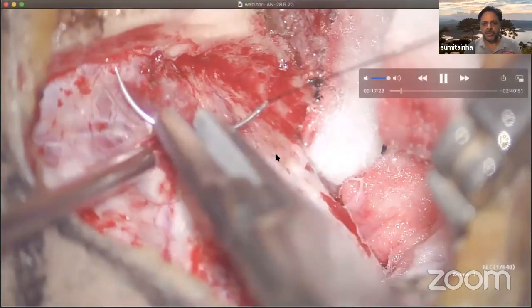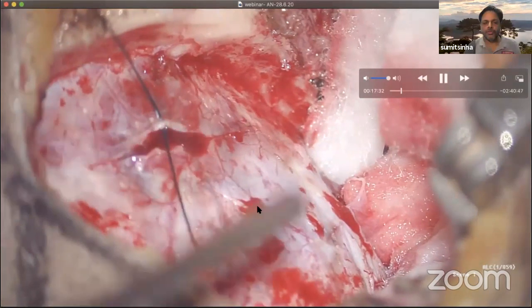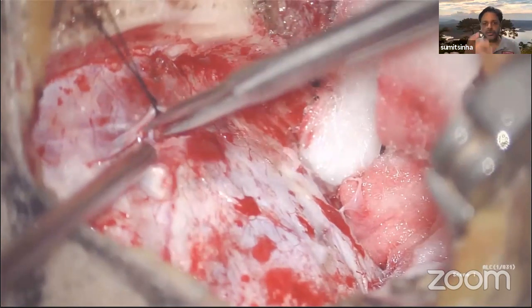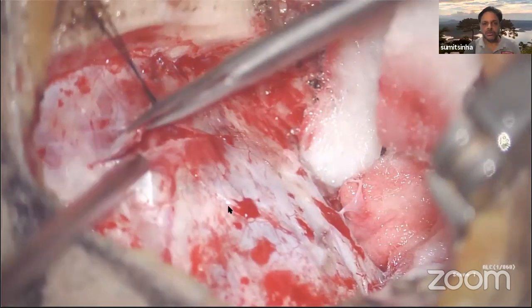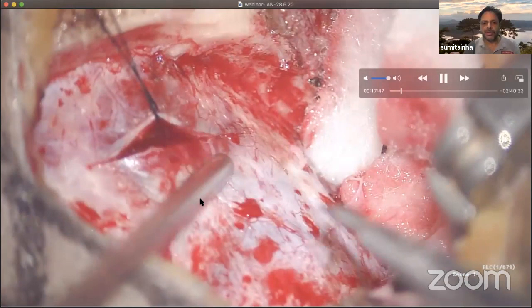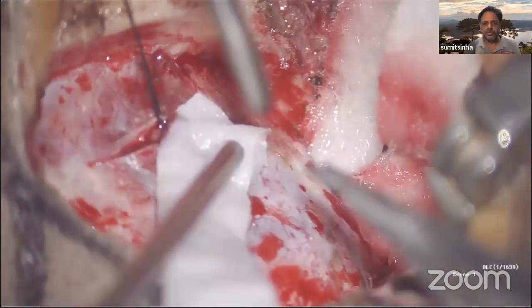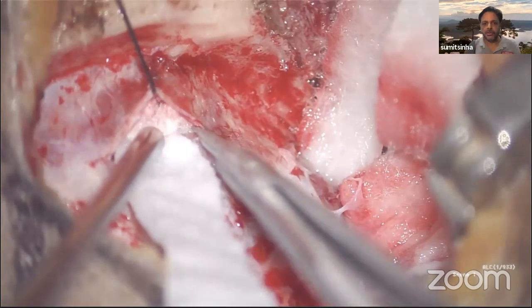So I prefer not to displace this dural flap away from over the cerebellar tissue. I like to keep it over the cerebellar tissue because this is nature's protection to the cerebellum, and I do not intend to fiddle around with this natural protective dural cover over the cerebellar tissue. Each and every step is important. Each step, small as it looks, adds up to reduce the patient's morbidity in the post-operative period.